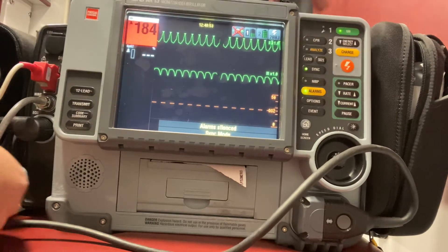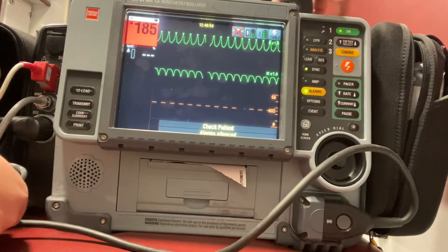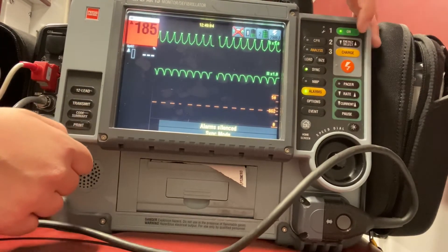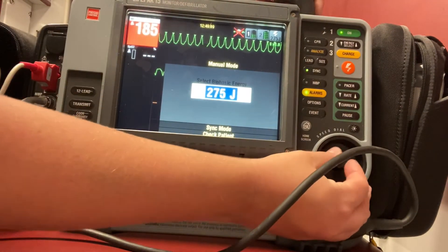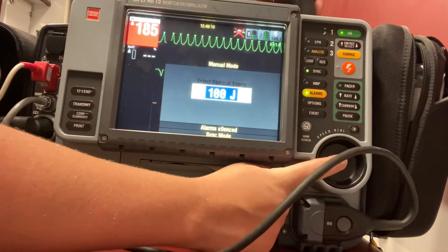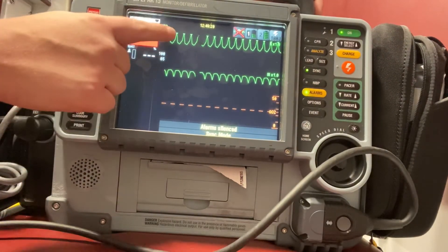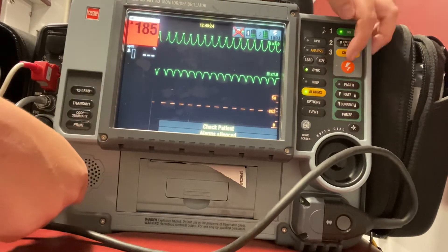My monitor is automatically set to 200 joules in case I have a cardiac arrest, so I need to change that energy level. I'm going to hit energy select, put that down to 100, and then press the center dial to confirm. Now I have my energy selected and my QRS complex synced, so I can go ahead and hit charge.